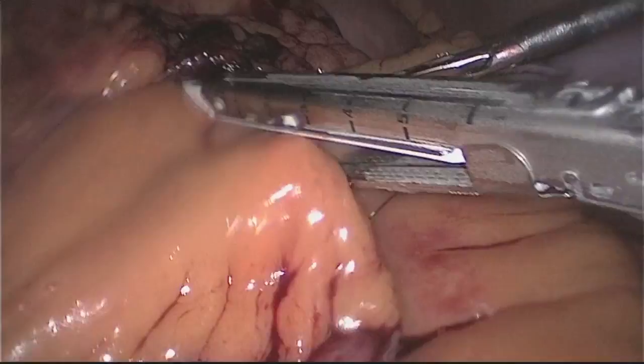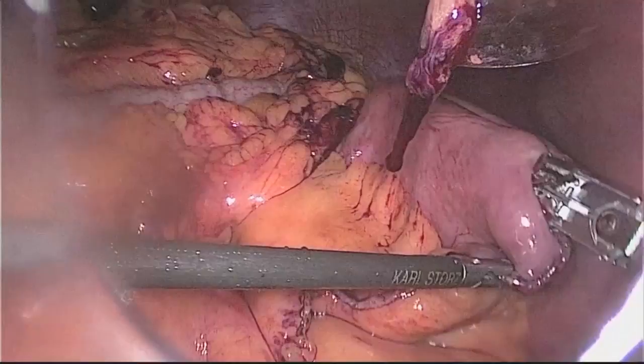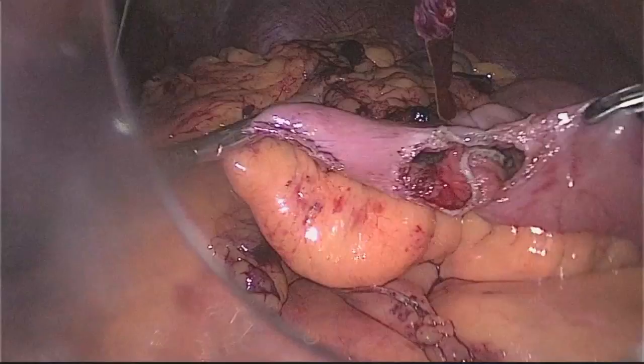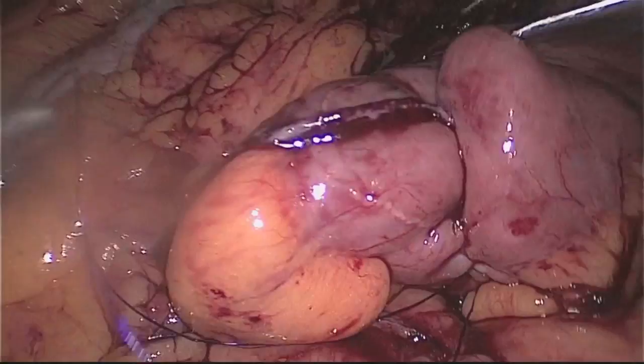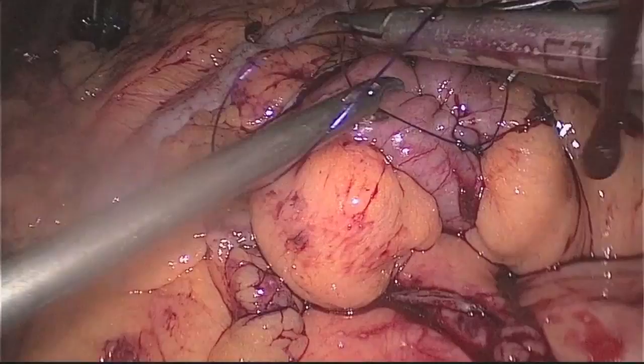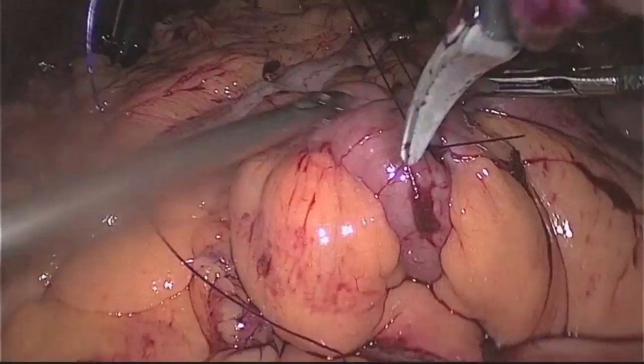The jejunojejunostomy was created 40 cm from the ligament of Treitz, creating a Roux limb 100 cm in length. After completion of the jejunojejunostomy and closure of the mesenteric defect, we proceeded with creation of the gastrojejunostomy.